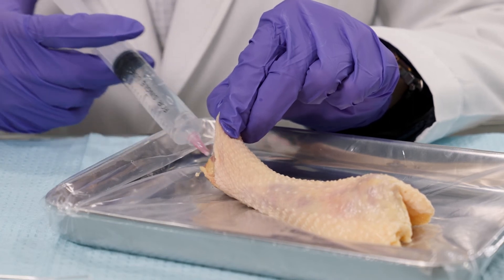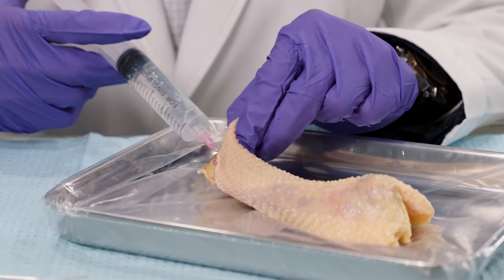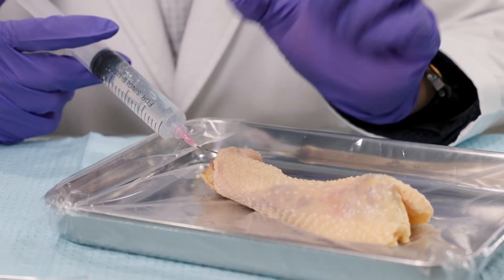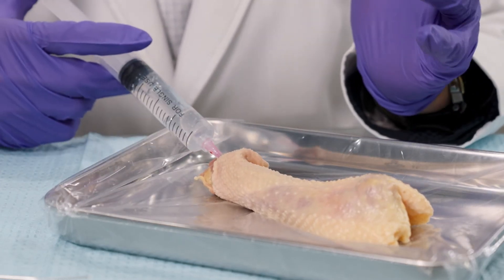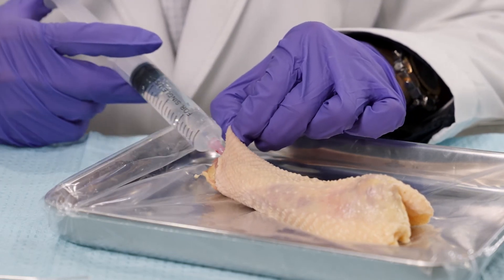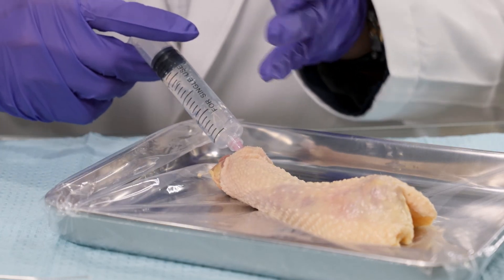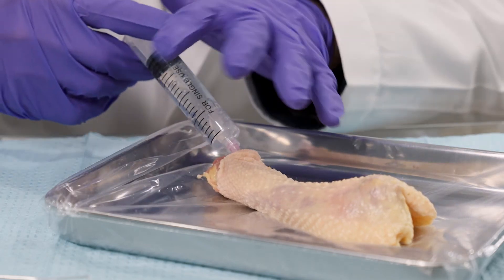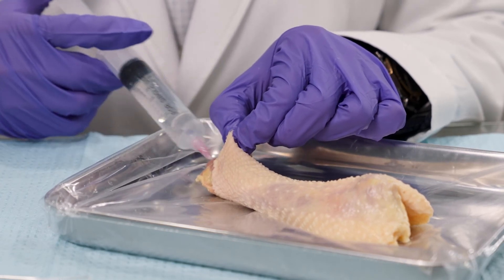We're using a blunt-tip cannula so we're not piercing anything. You may still experience some bruising, but this is a much safer modality than using an actual needle — there's a lot less chance of getting product into a blood vessel or artery. It's really important that the product is delivered uniformly and symmetrically in a circumferential manner, deposited evenly throughout the organ.